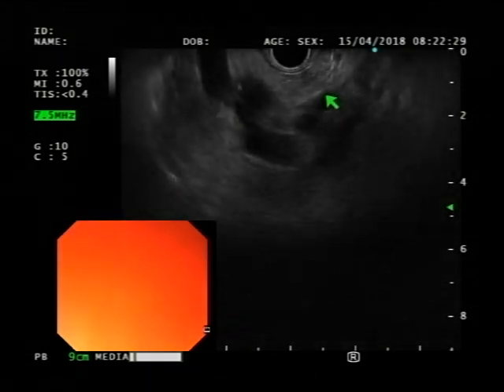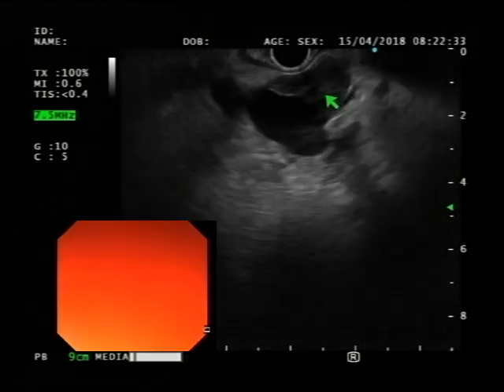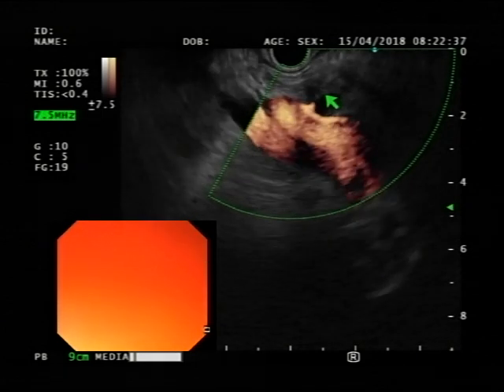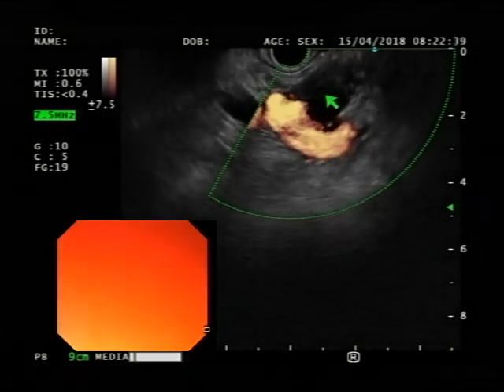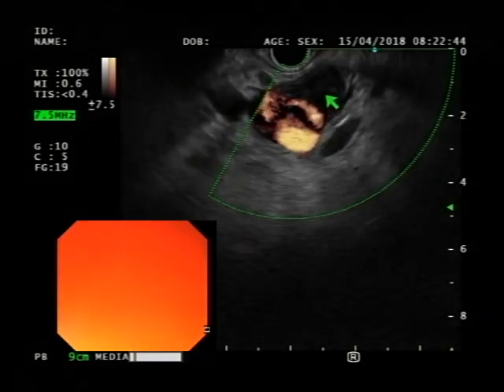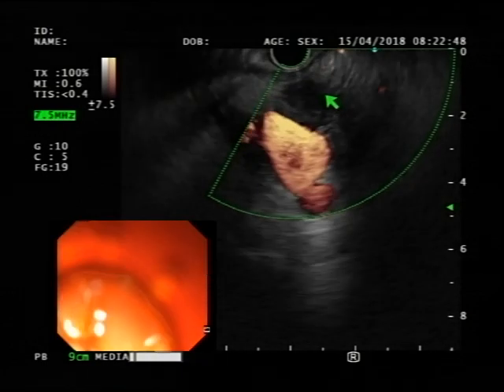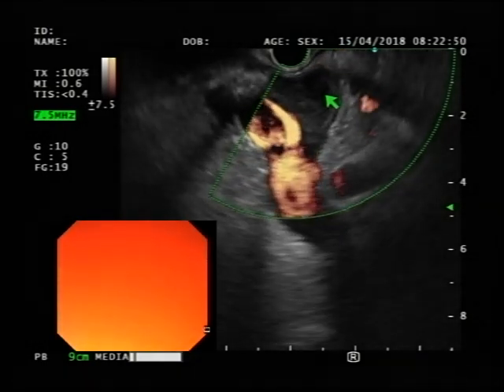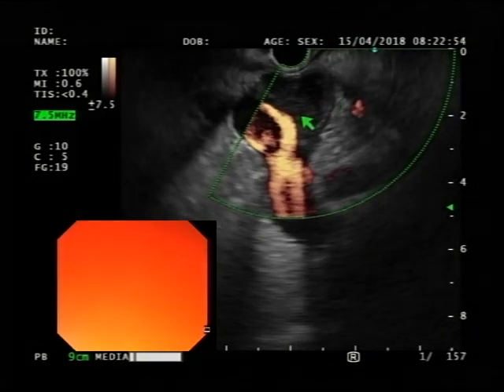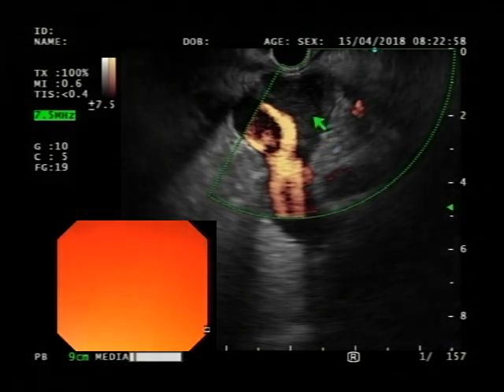You see that clot? Yeah, that was nicely shown there. Just freeze that for a second. I'm going to put a Doppler first there, okay? So here you see that it's a big clot, or could it be really a mass itself? I think it's right here. It looks more like a clot. Let me tell you why I am saying that, but I think we may have to do an FNA on that.